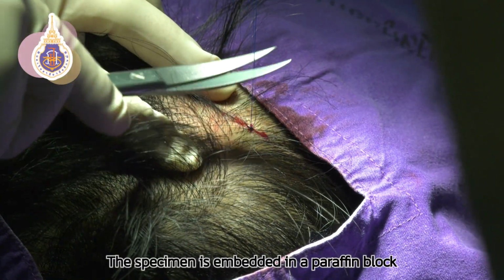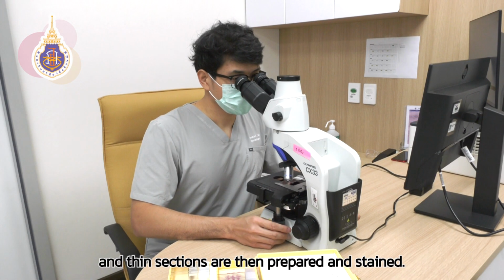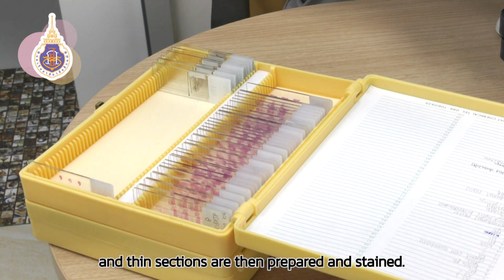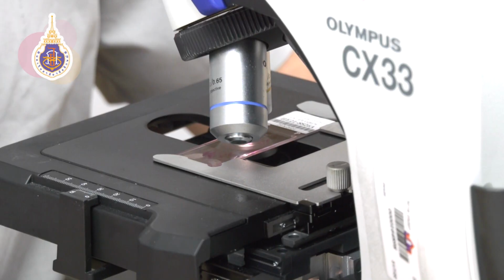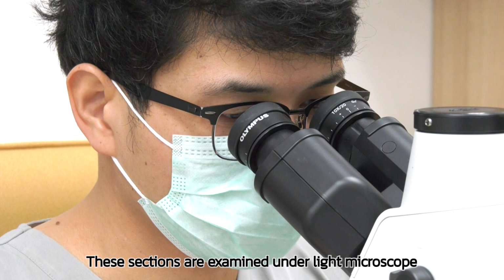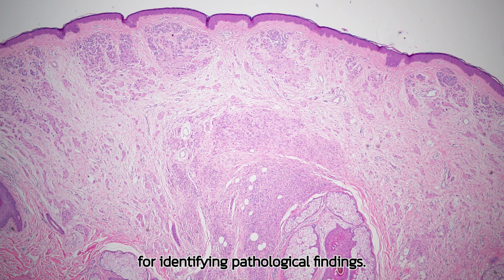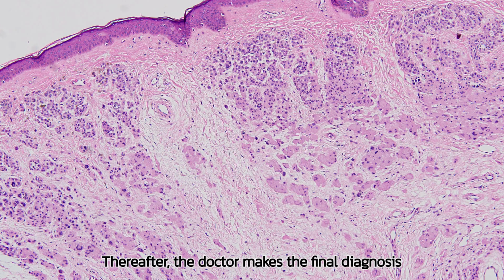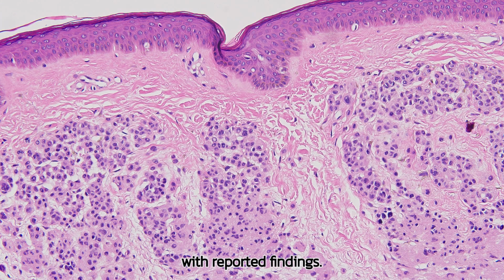The specimen is embedded in a paraffin block and thin sections are then prepared and stained. These sections are examined under light microscope for identifying pathological findings. Thereafter, the doctor makes the final diagnosis with reported findings.